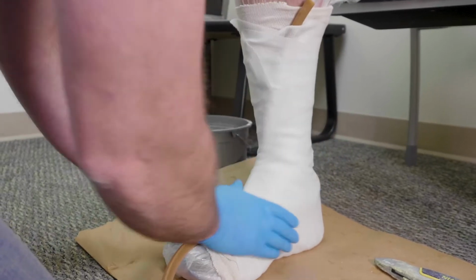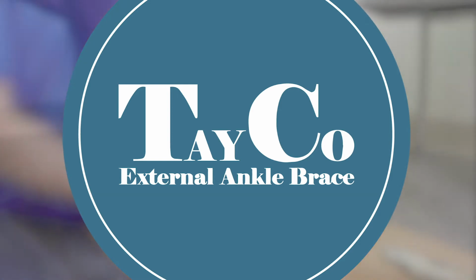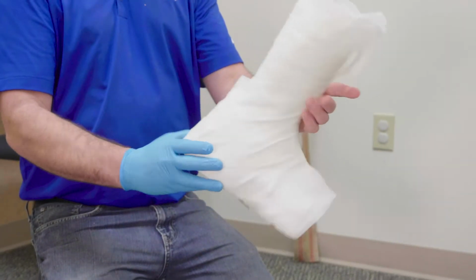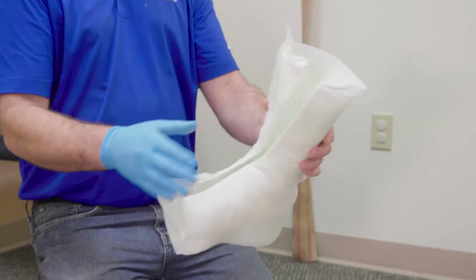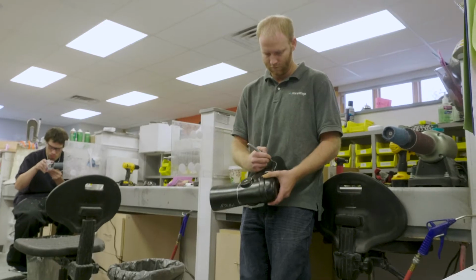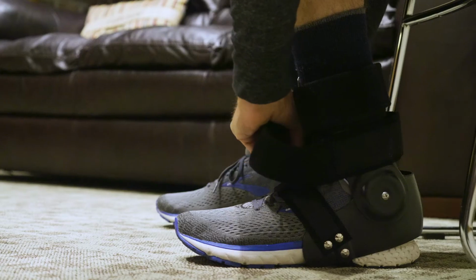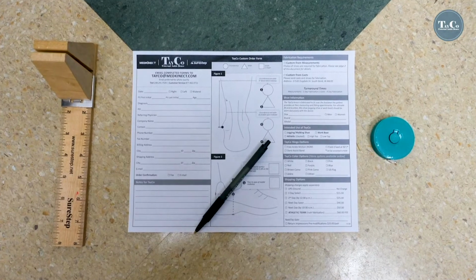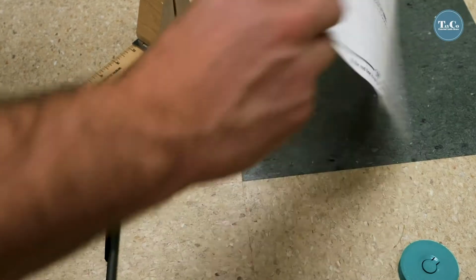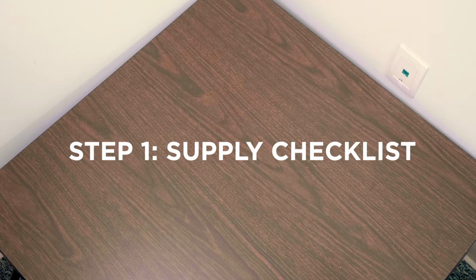How to cast a TayCo over the shoe. In some cases, such as moderate to severe ankle deformities, it may be necessary to create a custom cast for your patient's custom TayCo brace. This cast can be sent directly to SureStep, where our fabricators will create a custom TayCo that's sure to be both comfortable and supportive. Keep in mind that for mild ankle deformities, the patient can be accommodated by TayCo's usual custom measurement process. Let's take a look at the tools we'll need to create a custom cast.